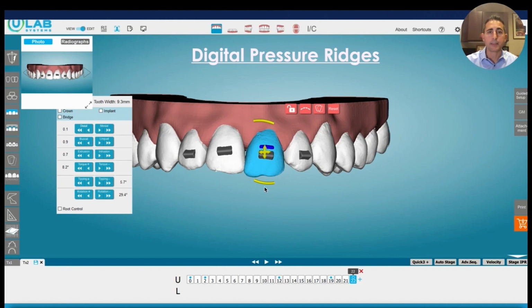I'm not going to get this much expression of the movement. The teeth have already told me what I'm going to get. I just need additional movement relative to what I've already gotten. And this is the most simple and predictable way to do that. I don't need to rescan the patient.